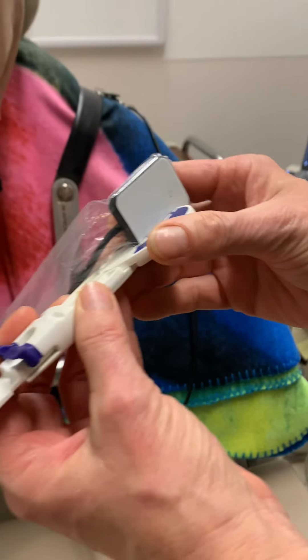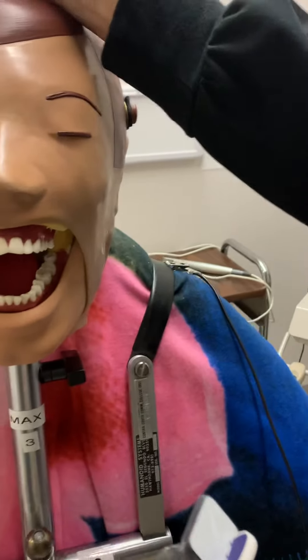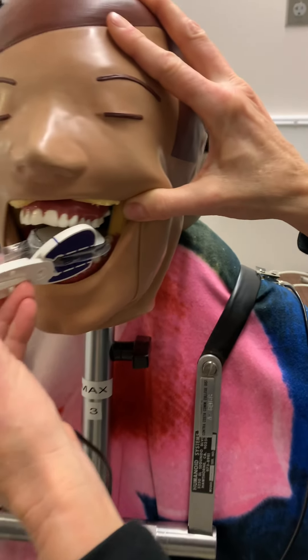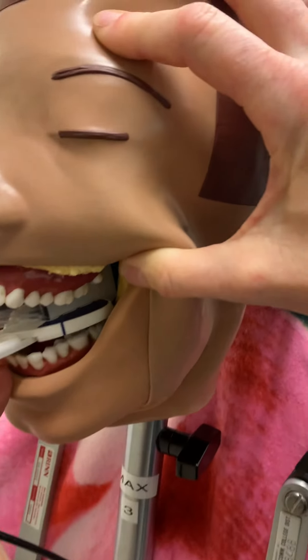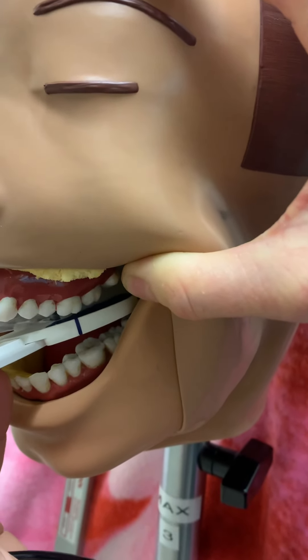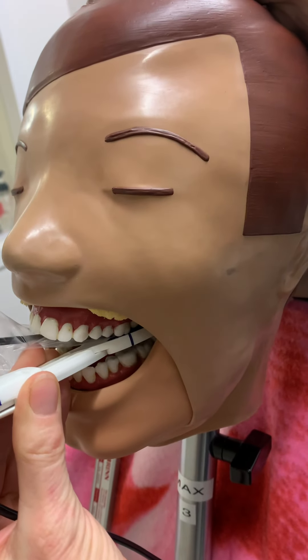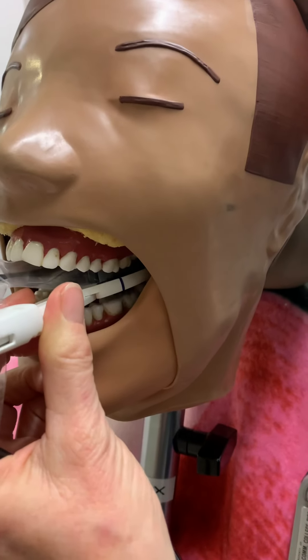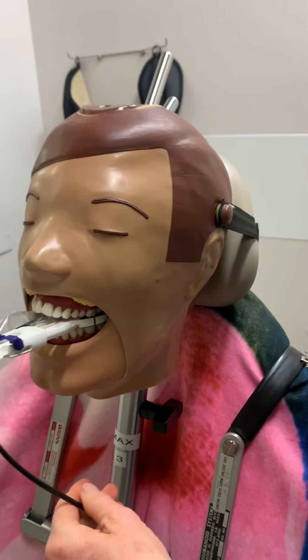I'm going to set it up just like I'm going to do any bisecting angle, and I'm going to take a look into my patient's mouth. I'm going to place it just so that I can see that that tooth is going to be in my image, and I'm going to place it directly onto the tooth and close down, making sure the sensor is staying in the right position — which it looks good — just till the patient is closing.